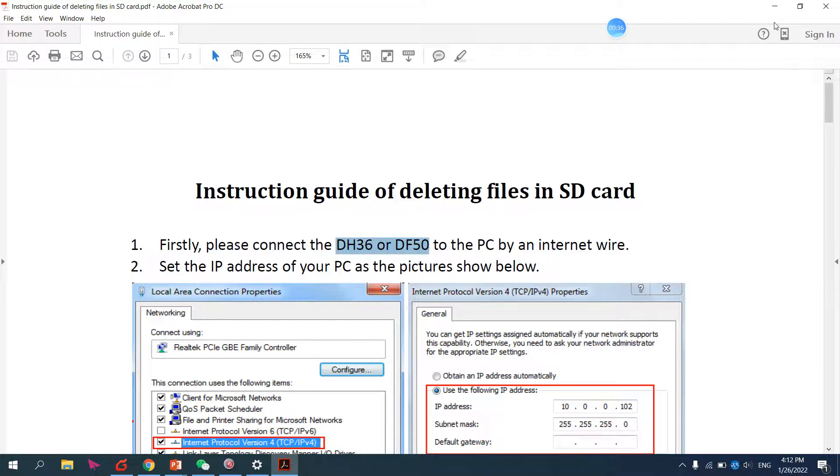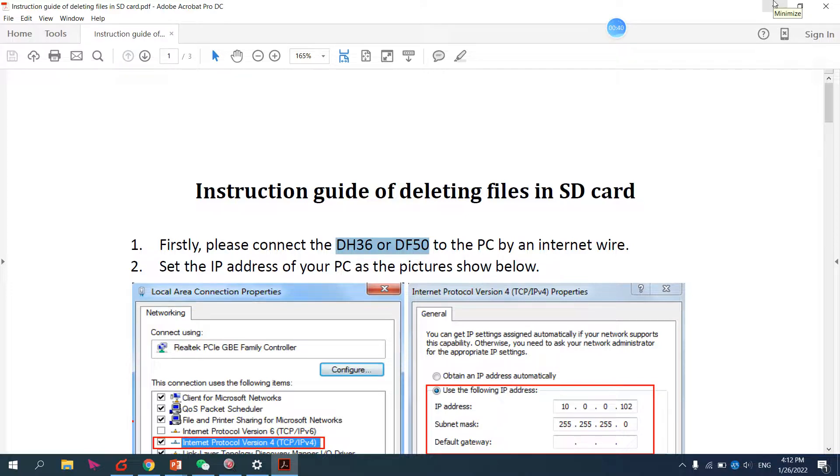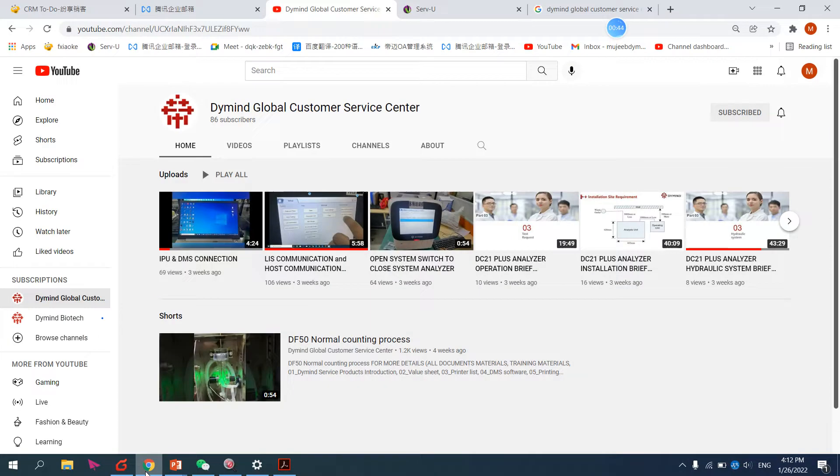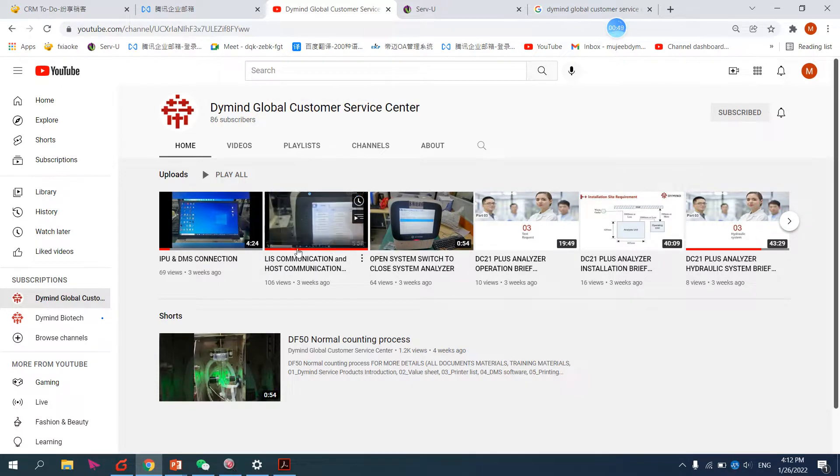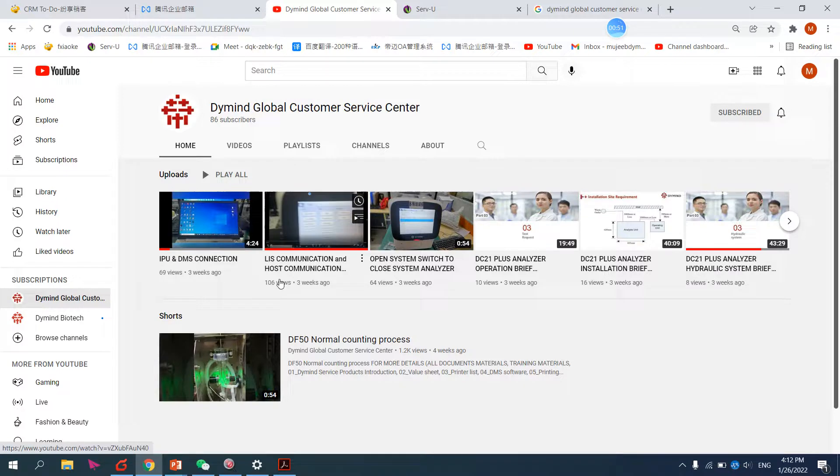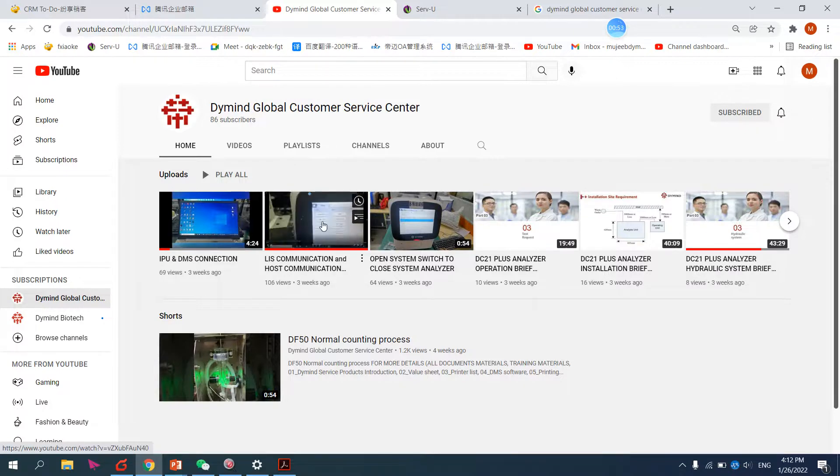We already have a video on our YouTube showing how to connect the PC or laptop with the analyzer. This is our YouTube channel: Diamond Global Customer Service Center. Watch the video on LIS communication and host communication.